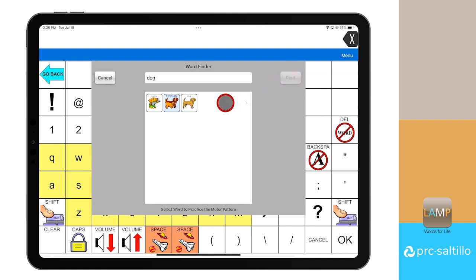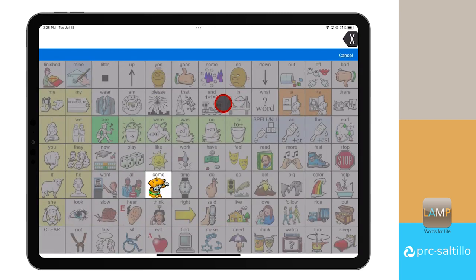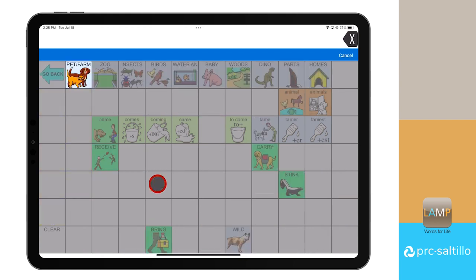This will pull up a window with the icon sequence for the target word. Select the icon sequence to practice the motor pattern for that specific word. Select the highlighted icons to locate the word you are trying to find. All other icons in the vocabulary will be grayed out to draw attention to the pathway you selected.